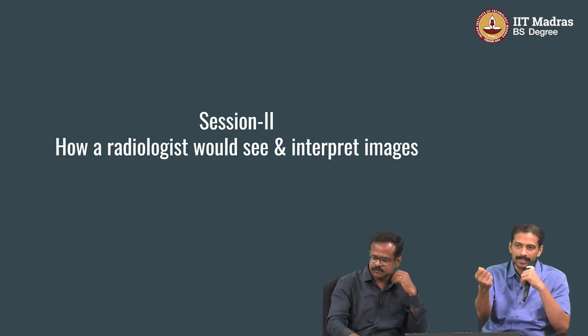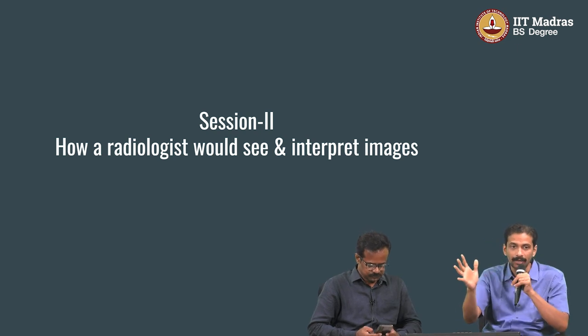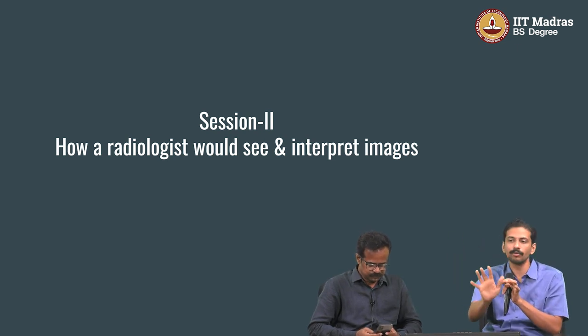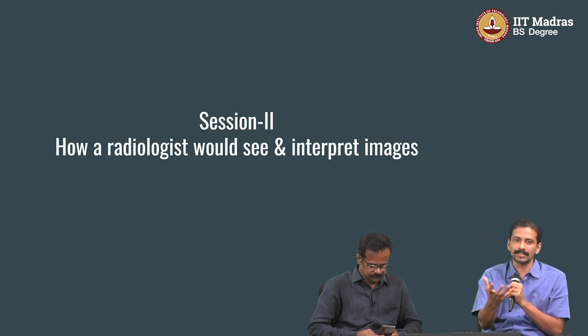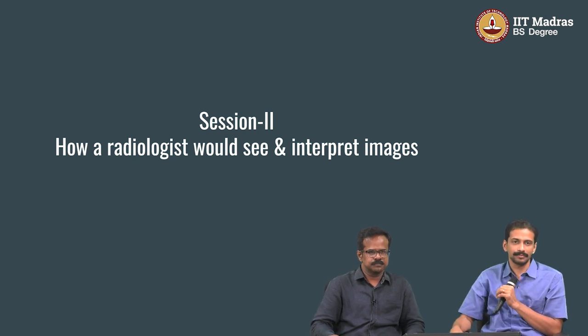You will just get images, right? But if you want to arrange it in a particular way, interpret it in a particular way, or project it in a different way, you won't be able to do it. Although at its core, DICOM is a JPEG image with a lot of metadata, which is very critical metadata.